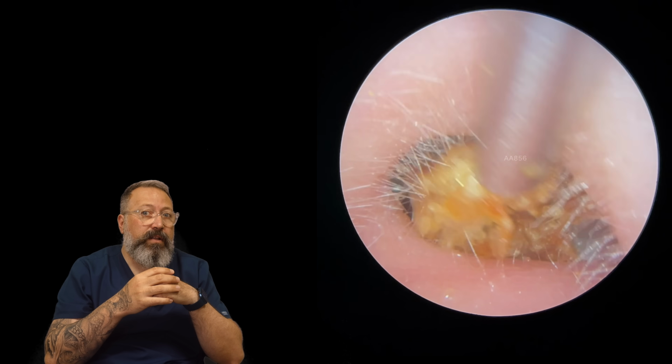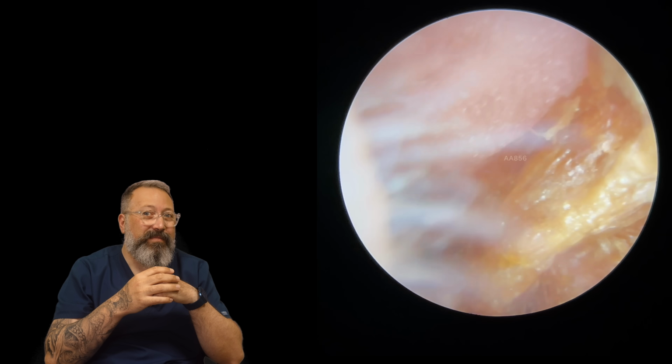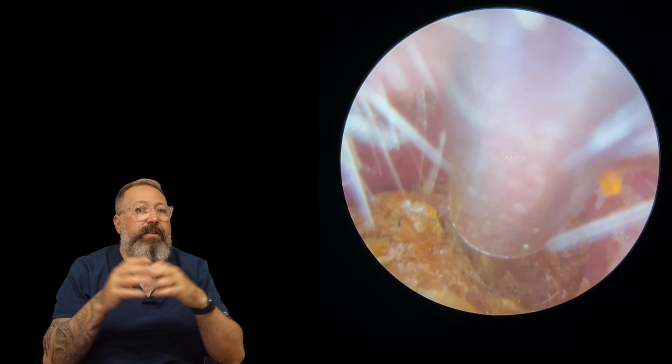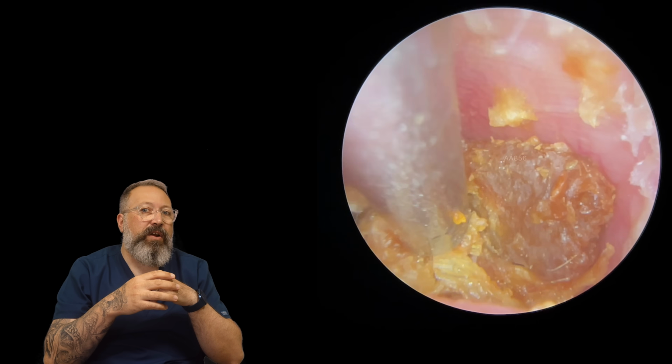There we go, a little bit more. Look at that, now that is keratin. Look at that piece. So you can see why this was just so firmly bound together. Now we're into the deepest sections. But notice how the wax is a little bit drier at this point.